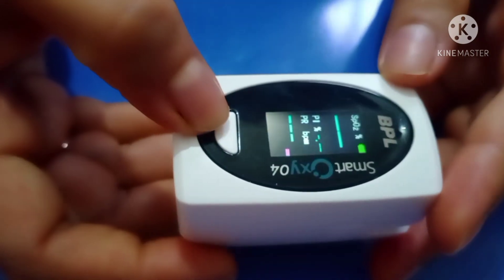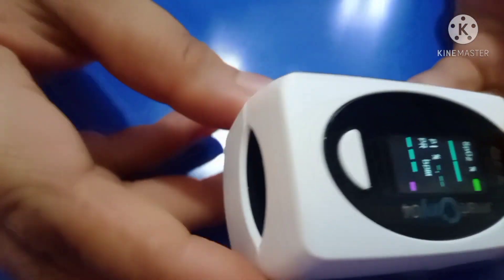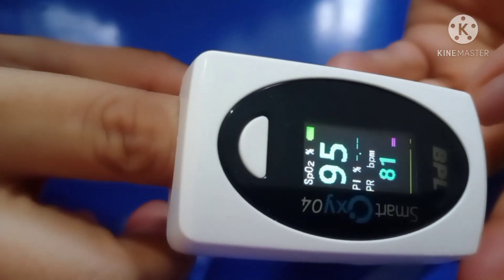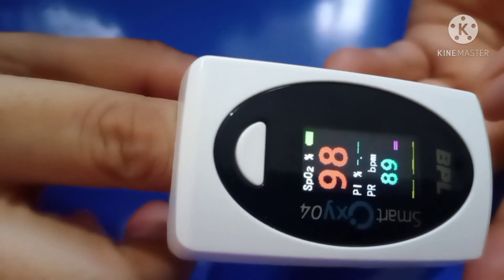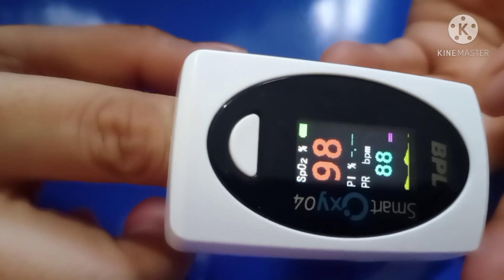Now let us see how to use it. First you have to turn it on and check the display, then insert the finger properly and wait. It will show SpO2 and heart rate along with the unit.